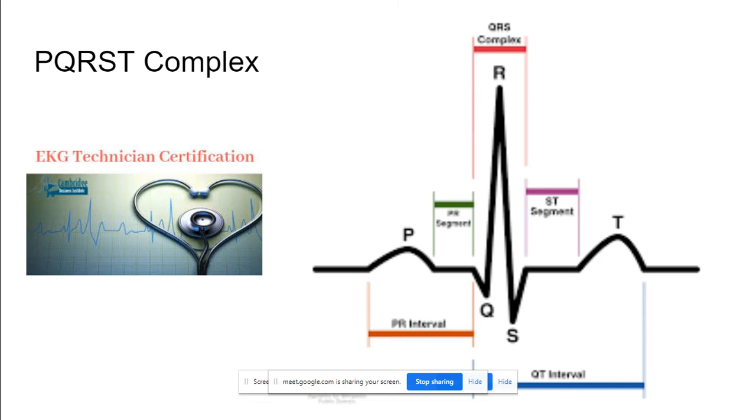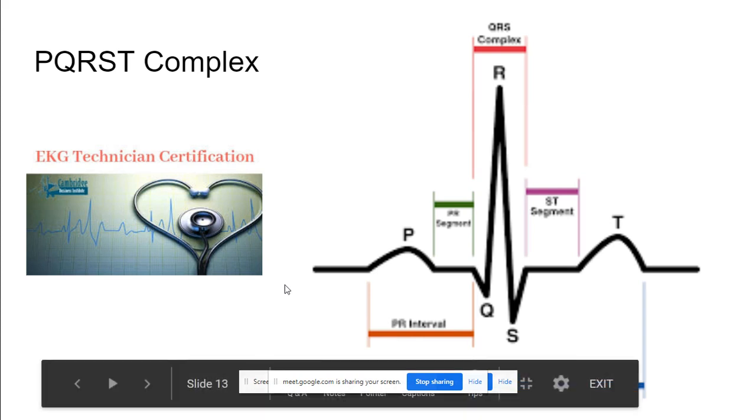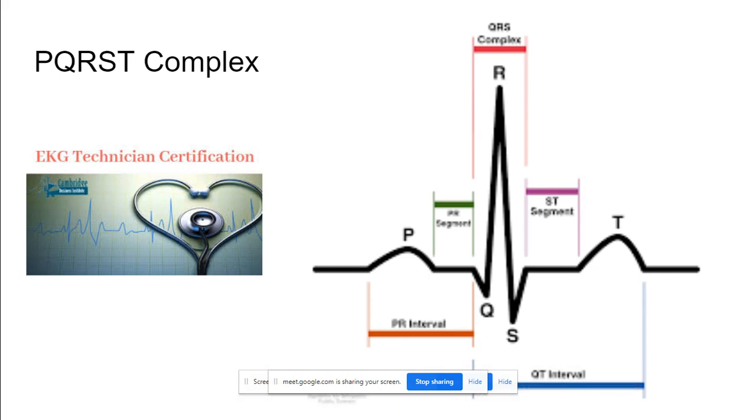You could use your calipers to help count. Whenever I used them, I always got the question right, but I could never actually count the small box. I would get it wrong every time if I didn't use the calipers because it's too small still. Okay. So they were helpful in terms of pointing exactly to each box. Yeah, then I could get the exact answer, but when I didn't use them, I had to guess because I couldn't even read it. Okay. All right. That is what I'm hearing from other students as well. I believe that you can use those. I can't imagine they would say you can't use EKG calipers on an EKG test, but I'll find out for sure.